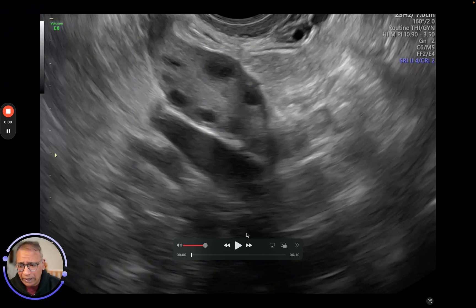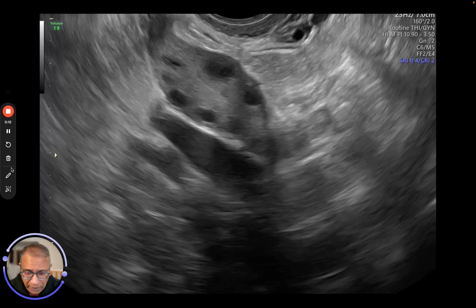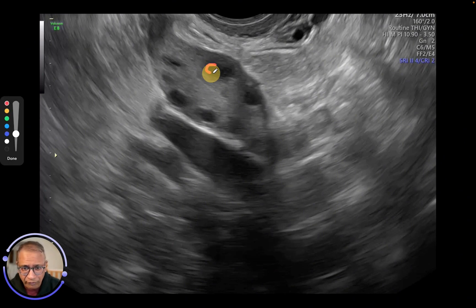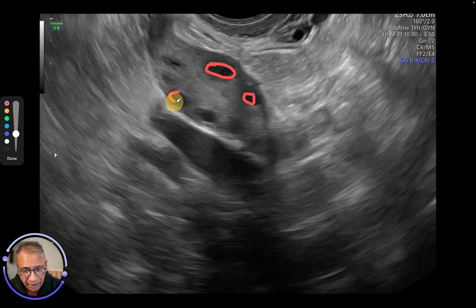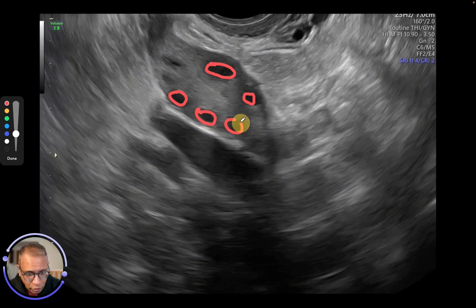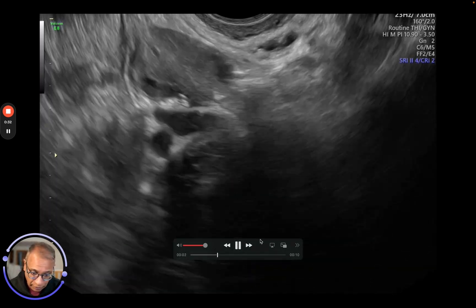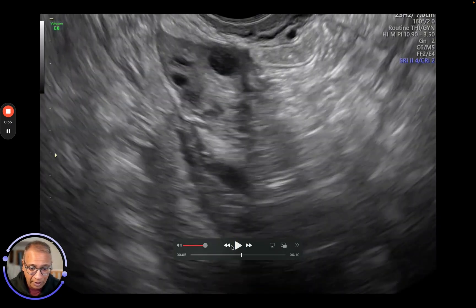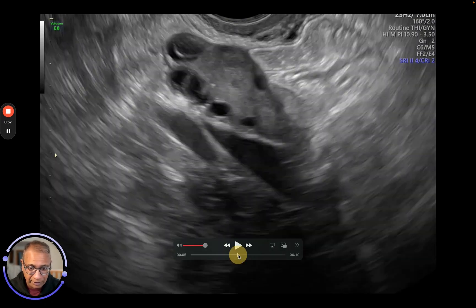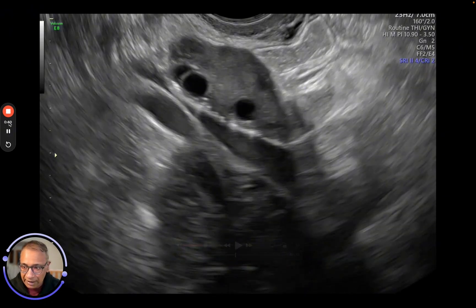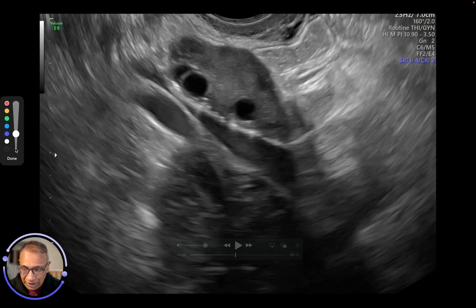Let's have a look at this scan. What we are trying to explain is what antral follicles are. On a scan, when we start IVF, these are the follicles that are going to be stimulated and will grow. This is a very good antral follicle count, and these follicles are of a much better size.